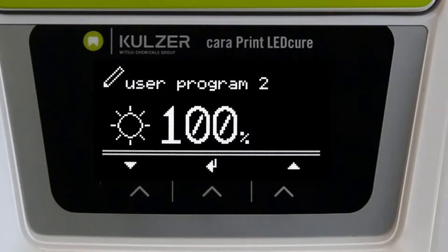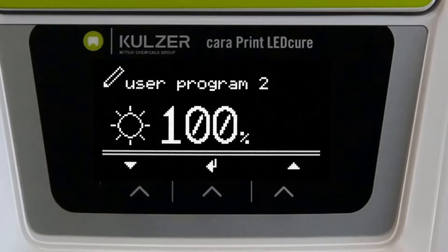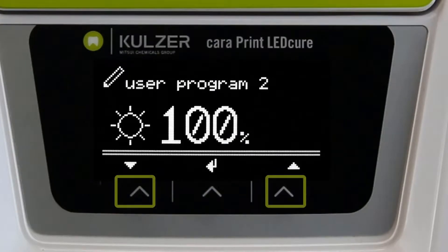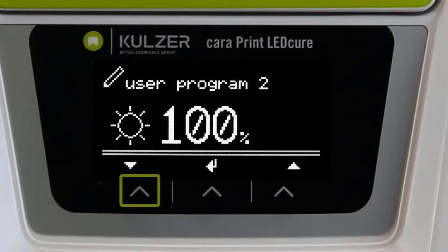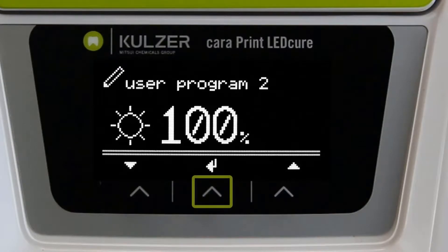First, the light intensity can be set. This is indicated in percentages between 10 and 100. Use the arrow keys to set the value — the right button to increase the value and the left button to decrease the value. Confirm each entry via the center button.